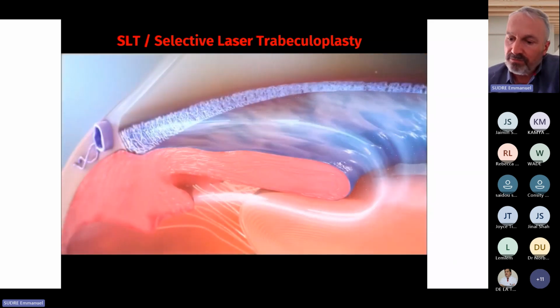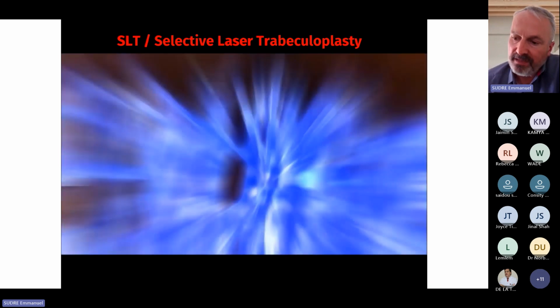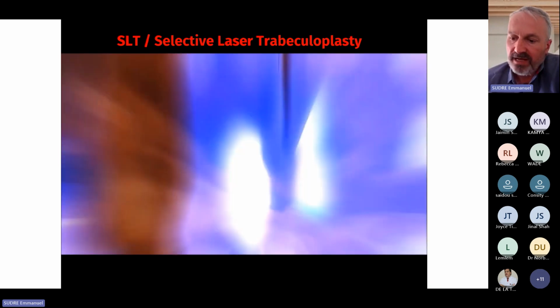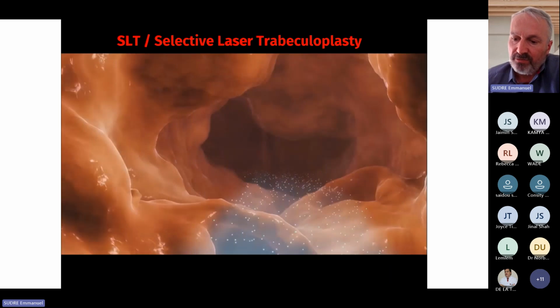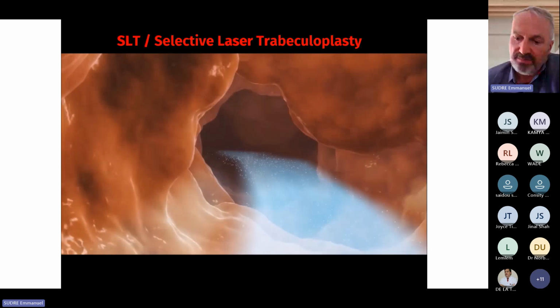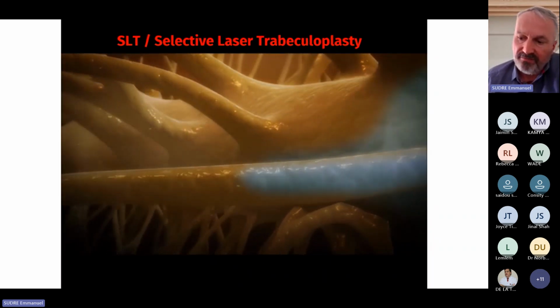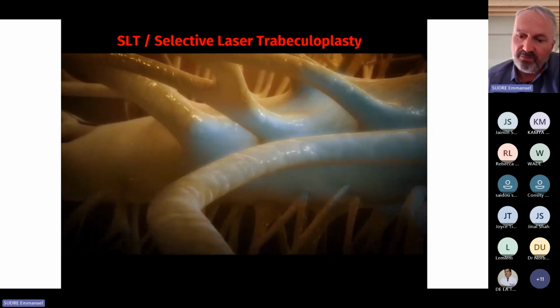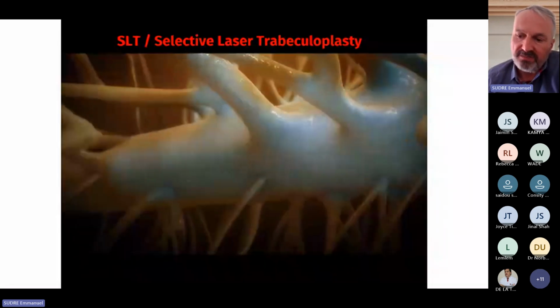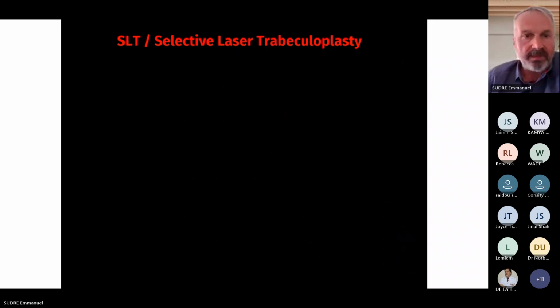One to 3 days after the procedure, IOP should drop significantly, although the IOP lowering effect could take up to 2 weeks in some patients. Depending on the postoperative risk of pressure spike, a follow-up visit can be scheduled at 1 week or 1 month, 6 months after the treatment.